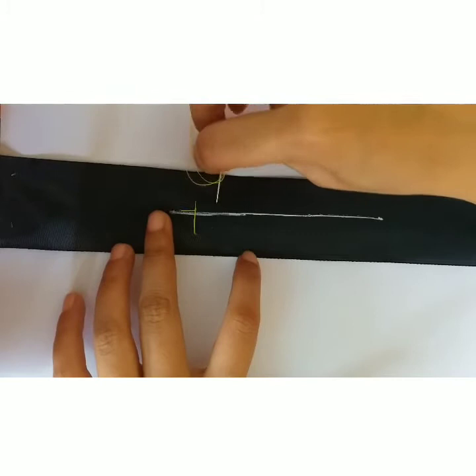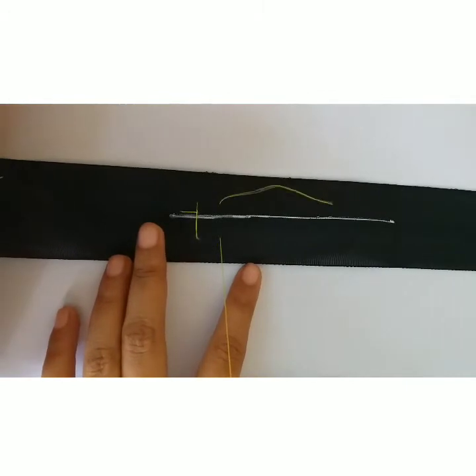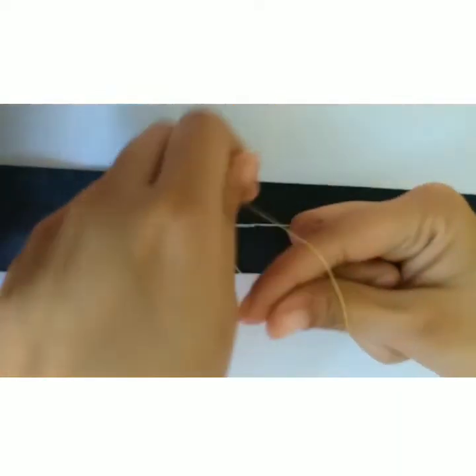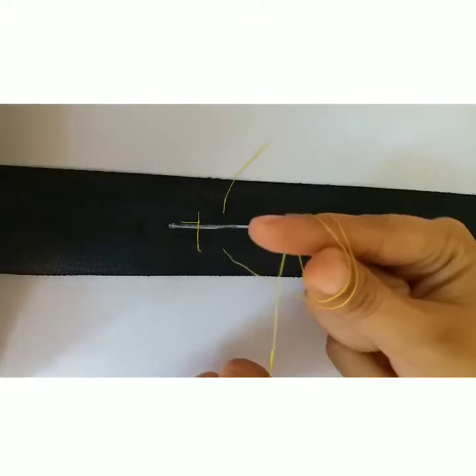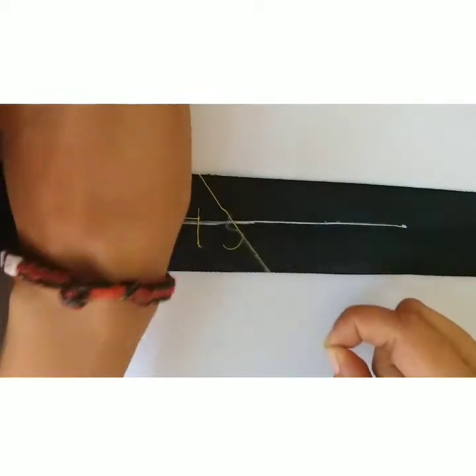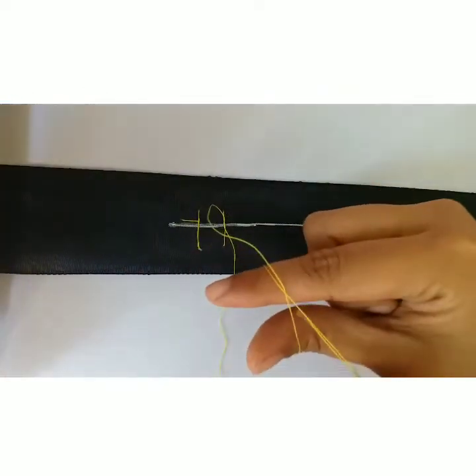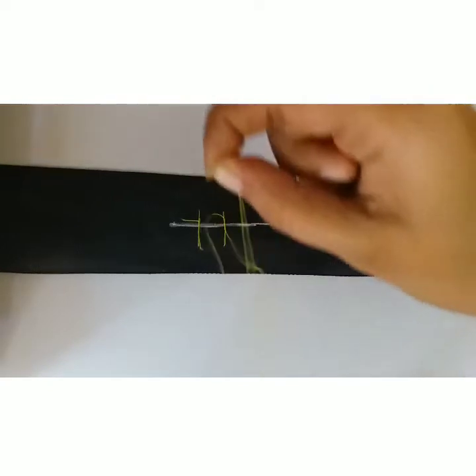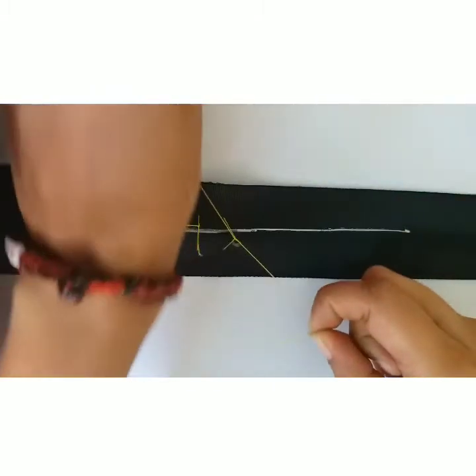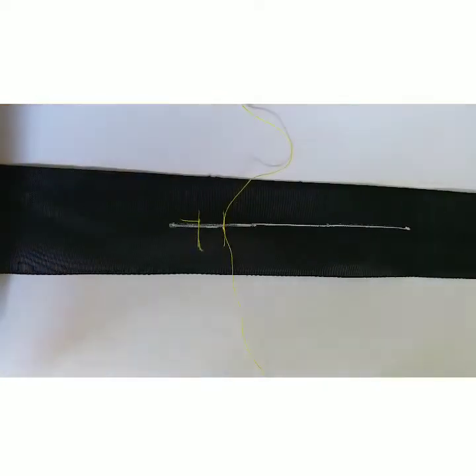Now, the other method is hand-tie method. The same method, we will hold the forceps with fingers and pass the thread through. Then I will wrap the thread around the fingers and bring my right hand towards me. Then I will take another throw and take my right hand away from me. This completes the surgeon knot, and now two additional throws, then cutting the excess material.